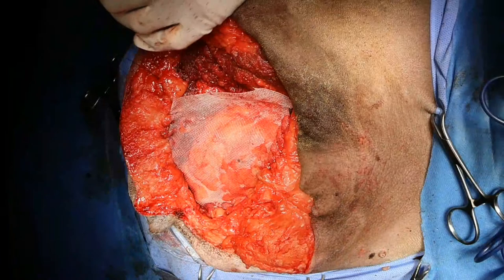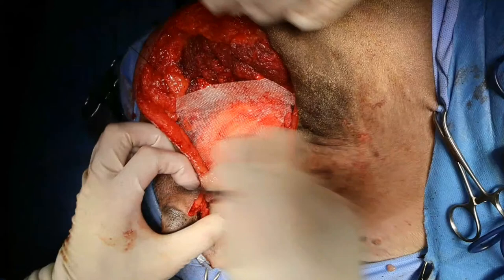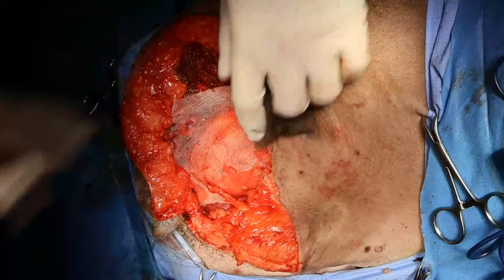Sean, you're just going to suture to the external fascia of the gluteal muscle, all the way back down to there. And then if we can get a little bit of fat to cover that, and then just pull this across and do an intradermal. Yep. Happy with all that? Yep.